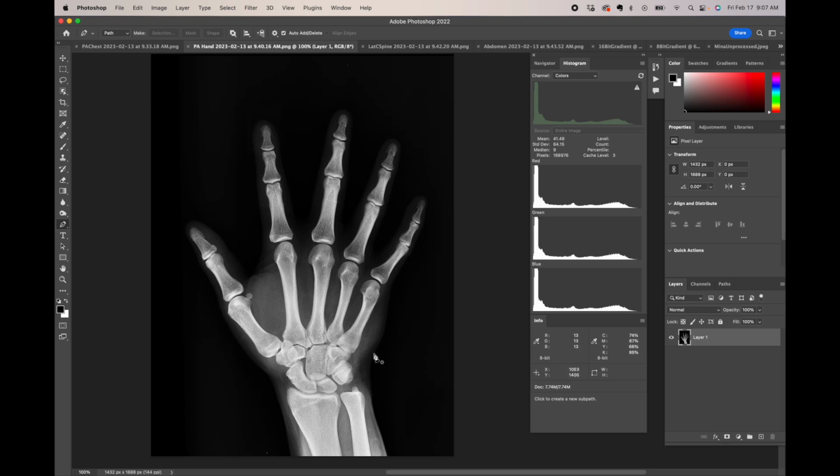Again, you notice that there is nothing that's just stark blown out white here. You have good bone detail. It's a good exposure, so everything's right, but the point I'm getting at is you see that this represents all this dark area. It's starting to go off the side of the histogram over here, which I'll get to in just a moment.